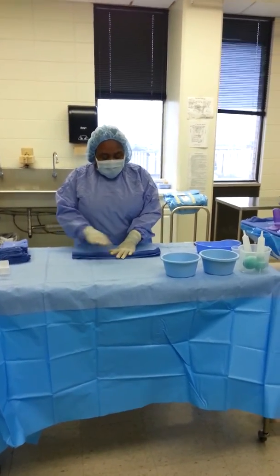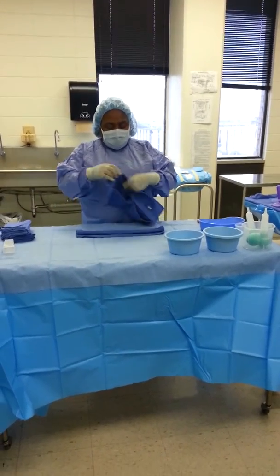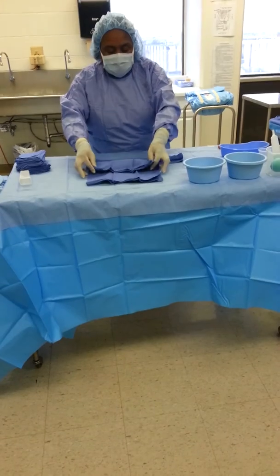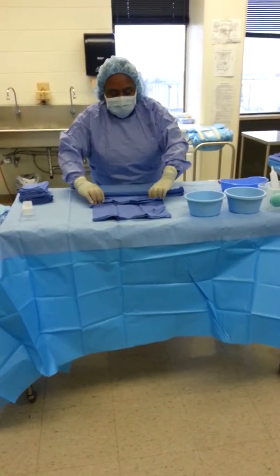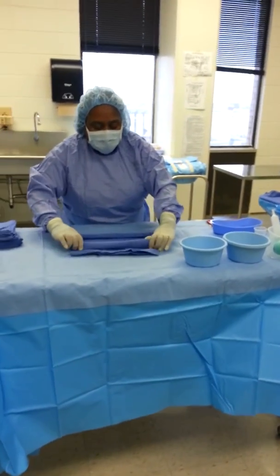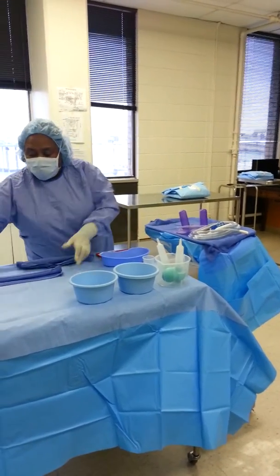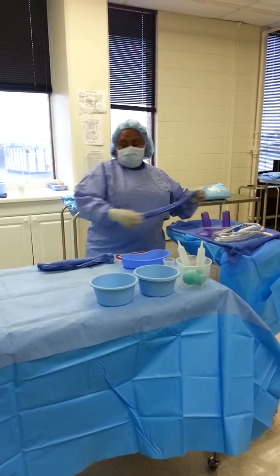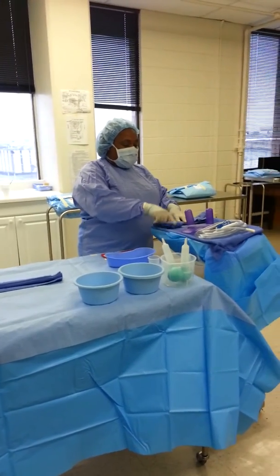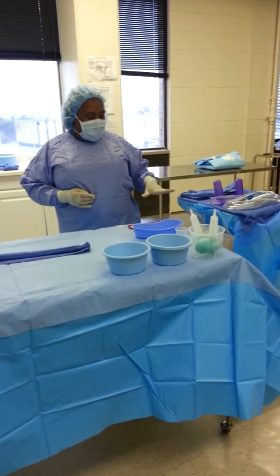I set it right in the middle of my table. I also have to do one for my mayo stand. This one, the back table, folds this way; the mayo stand folds this way. We're going to practice it, because you don't want your roll towel to hang over the edges. You see, that fits in. See how this one is too long? It's always at the open end, because your instruments are here, going this way: curved stats, straight stats, Allis, Babcock, all of that.